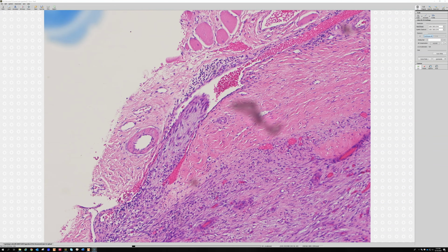Here is nodular fasciitis involving the lumen of a vessel. Do not be afraid, that happens. And in fact, you can see some cases of nodular fasciitis are purely intravascular, and they actually may be closely related to organizing thrombus, which also can look a little fasciitis-like. So that is not a sign of malignancy. In a lot of tumors, if we see tumor cells in a vessel, we get really worried. But in nodular fasciitis, that happens.